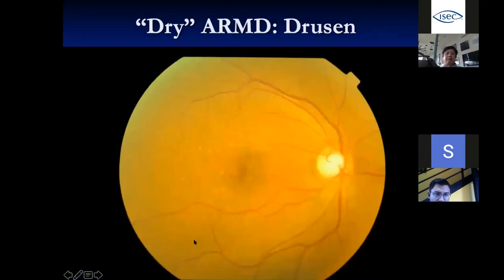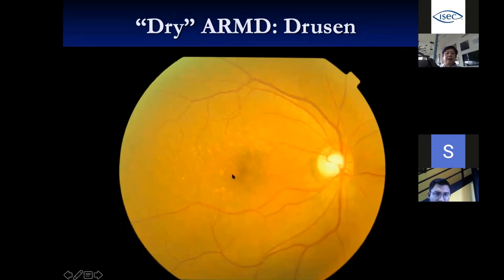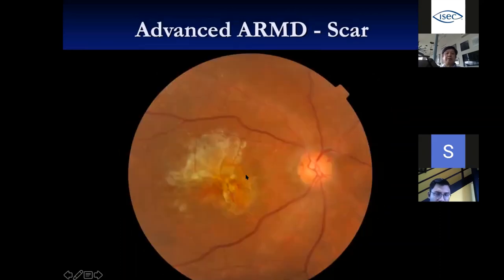In dry AMD on OCT, you don't see distortion in the retinal layers themselves, but you can see little humps of elevation at the RPE level — representing waste product (drusen) accumulation at the RPE level. If the patient has a scar, which is advanced AMD, there is really dense scarring that is not good for vision.